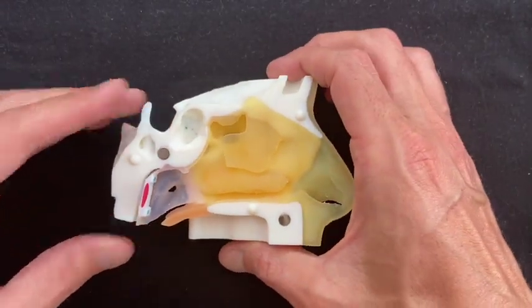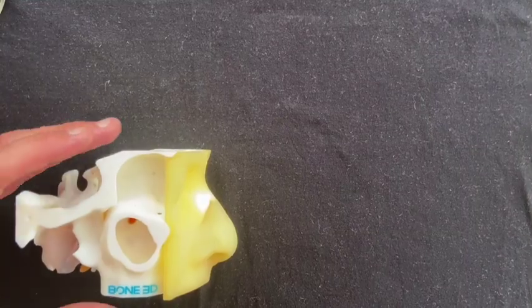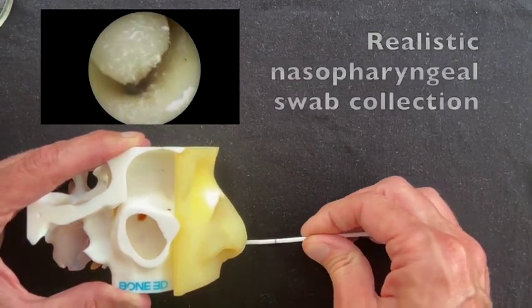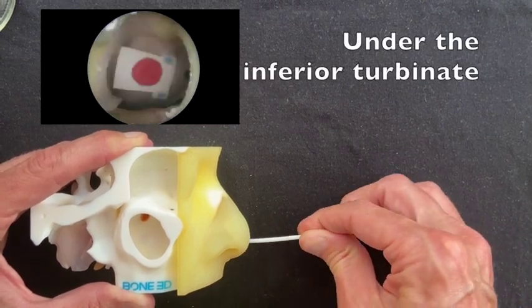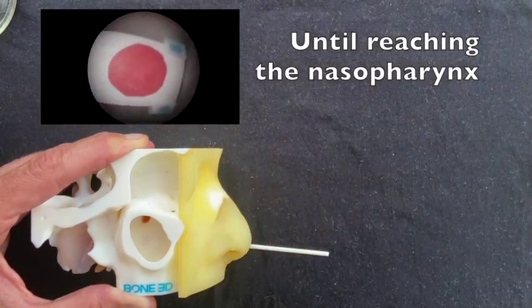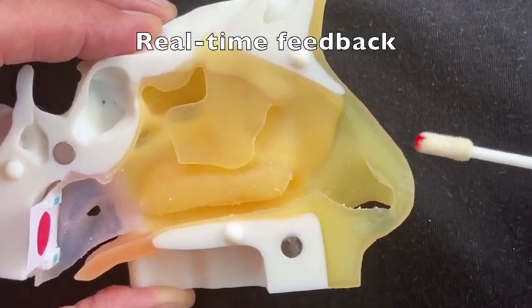Both parts of the simulator have magnetic contacts, so they can readily be assembled. The simulator allows the user to conduct realistic nasopharyngeal swab collection by inserting the swab through the nostril parallel to the palate and gently advancing it horizontally down to the nasopharynx where the colored pad is located. By coloring the swab tip, it provides real-time feedback to the user.